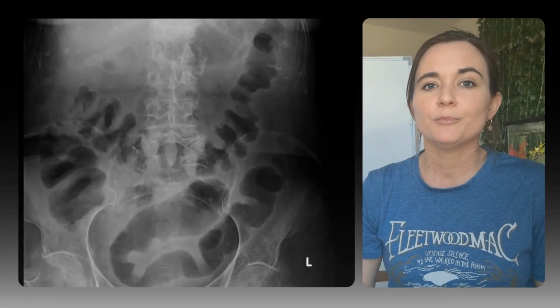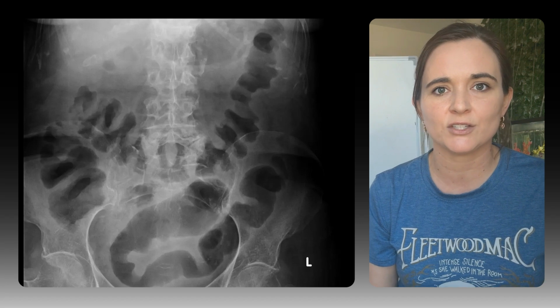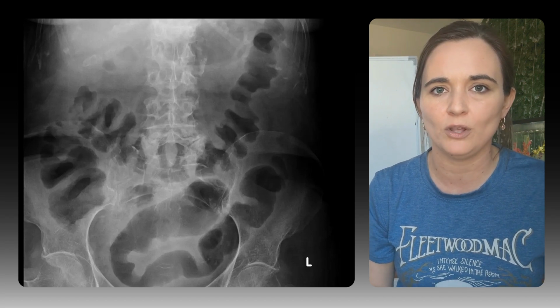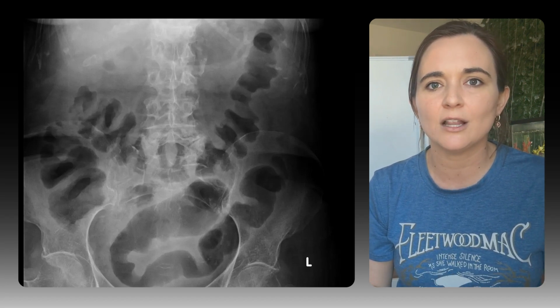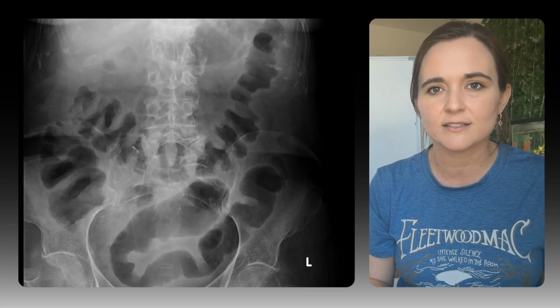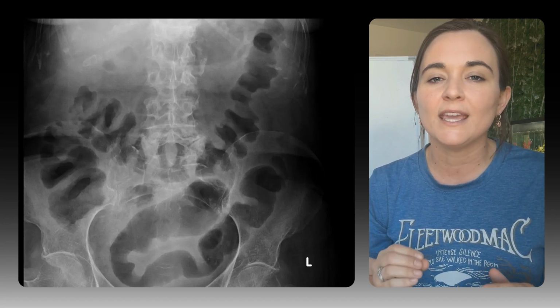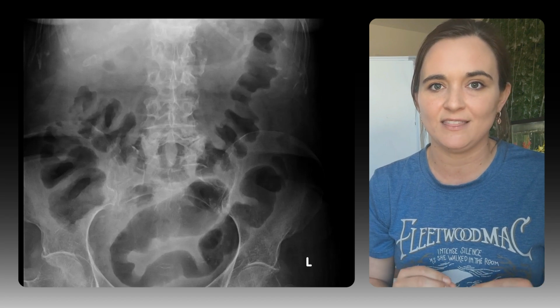Learn these patterns. They are tested, they are real world, and they matter. But wait, let's make this trickier. What if Mrs. Garcia's x-ray showed thumbprinting in the colon walls? Those soft, scalloped edges aren't just shadows. They're a sign of ischemic colitis, where blood flow to the bowel is compromised. The ARRT loves testing this.